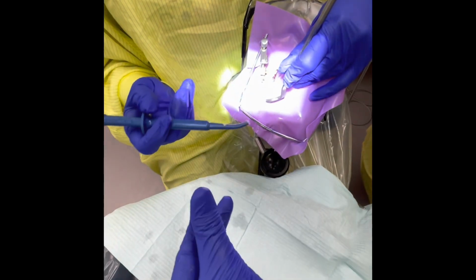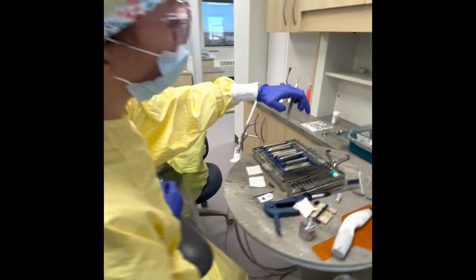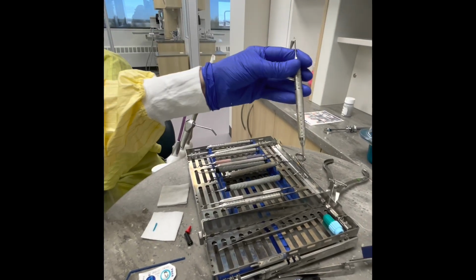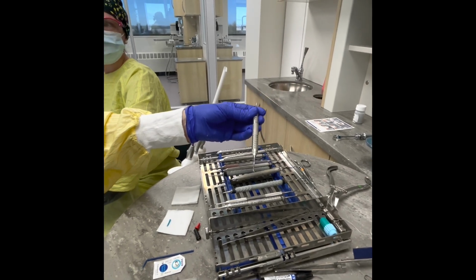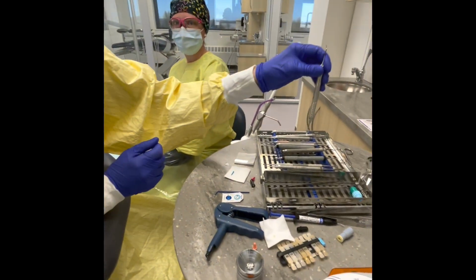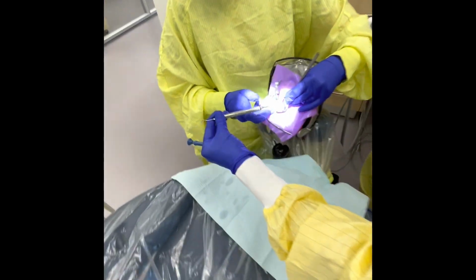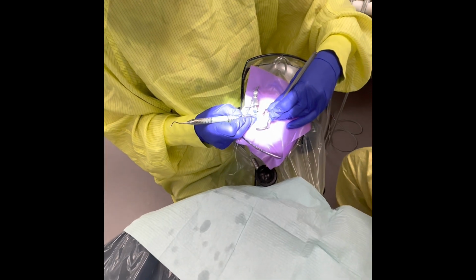Now, Stacy, I'll take the same end of that condenser, please. Okay. So same end, I'm going to come over to my rotating countertop and make sure that I do that same end or opposite end over top of my cassette. I don't want to do it over top of my lap. That's very dangerous. So I've changed it to the same end. I'm going to come back into the transfer zone and give Amanda her same end. Would you like any more? That'll be okay, thank you.